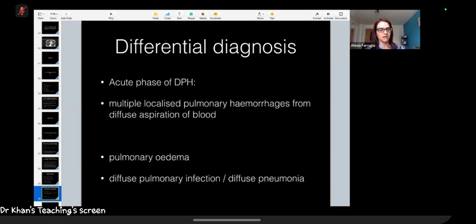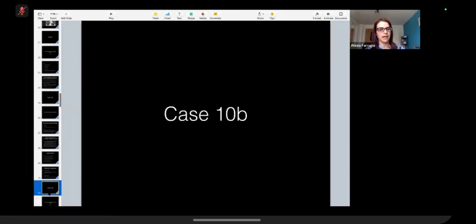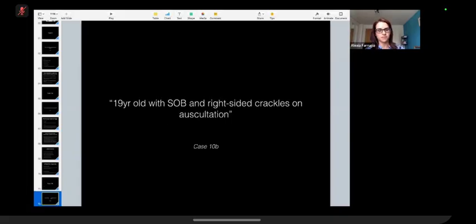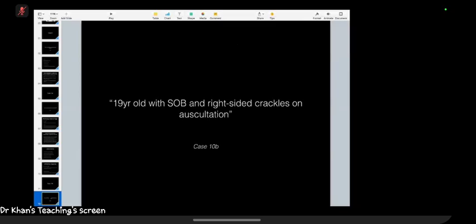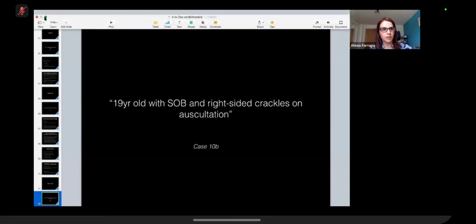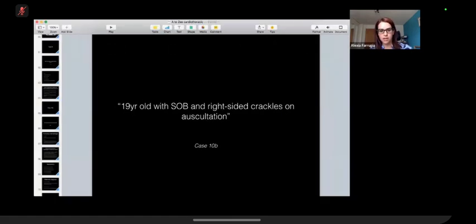Now I have a second case, which is somewhat related, also in a 19-year-old, another 19-year-old. Do you want to take this one as well? Yes? Great. Okay, so this chap presented, also a first presentation, he had never been to hospital before. He presented with shortness of breath and right-sided crackles on auscultation. And I'll bring up his imaging.